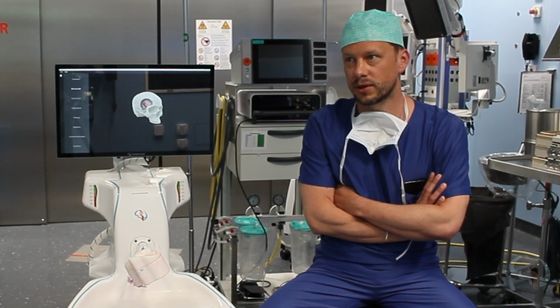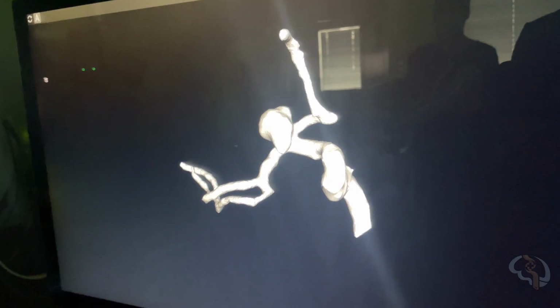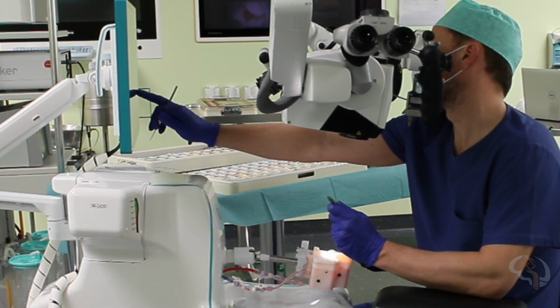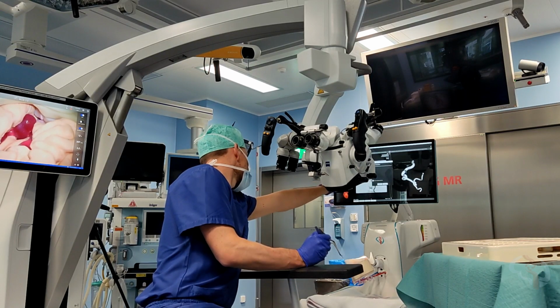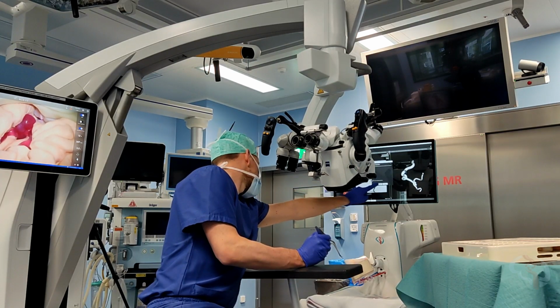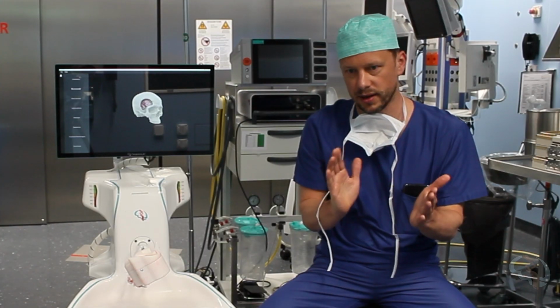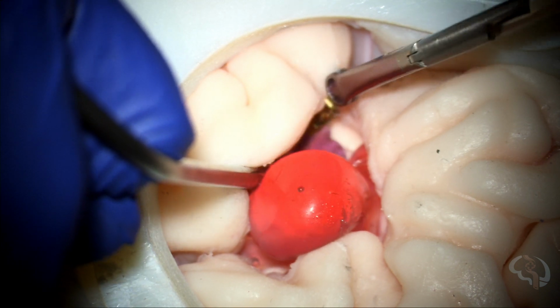In the normal radiology images, you have predefined planes, three planes in the normal images. Then you can reconstruct it in 3D and move it in the direction that you would like to look at. But then everything else is missing. You're not using your hands, you're not using the haptic feedback, you're not using the little constraints that you have in terms of angle and vision that you can use here. So the model really shows you a situation that comes very close to real life.